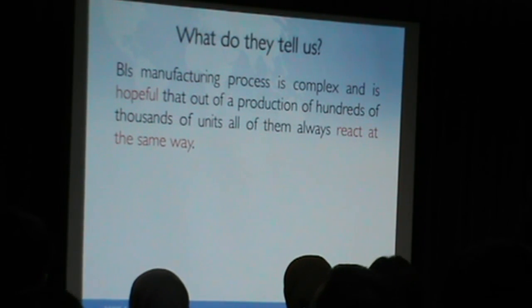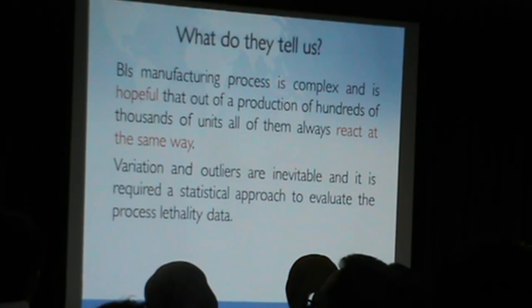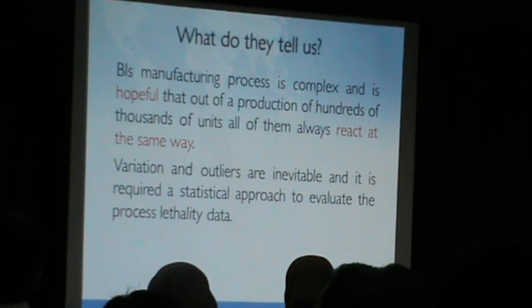Remember, live organisms, they can react in different ways. So variation and outliers are inevitable, and it requires a statistical approach to evaluate the process lethality.